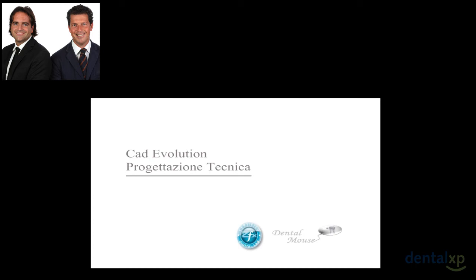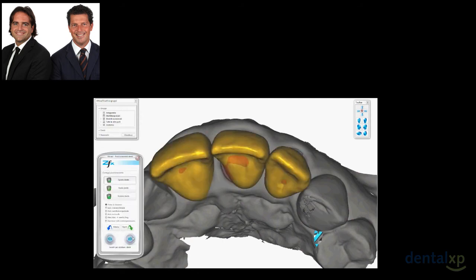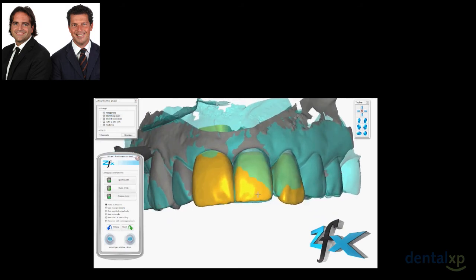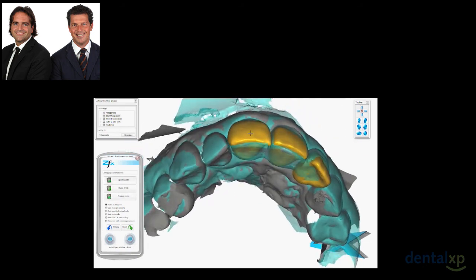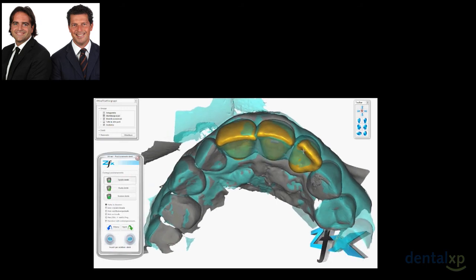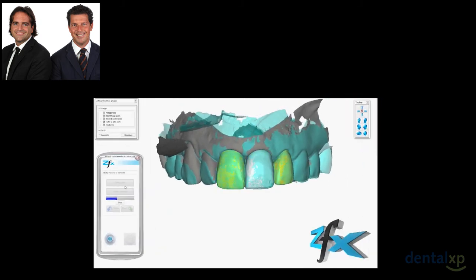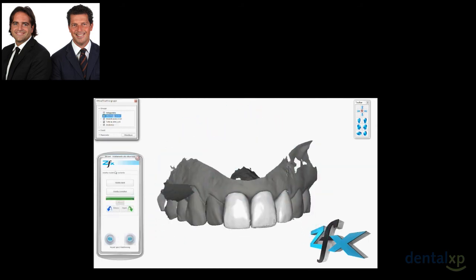This is our technician starting to work. This is Matteo Dondi, Lucas' son, who right now is just matching our temporary to the software library provisionals. You can see that he is smoothing it up and placing them in the position that he thinks is most appropriate, and then just by clicking this button, the software starts matching our provisional with the provisional of the library.